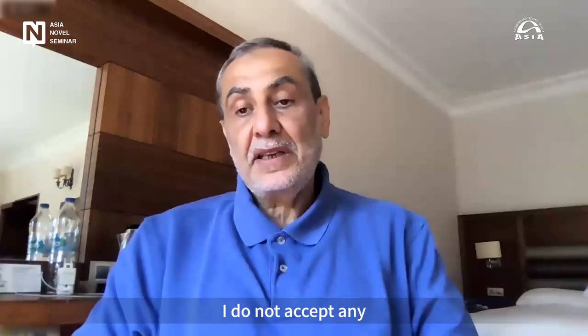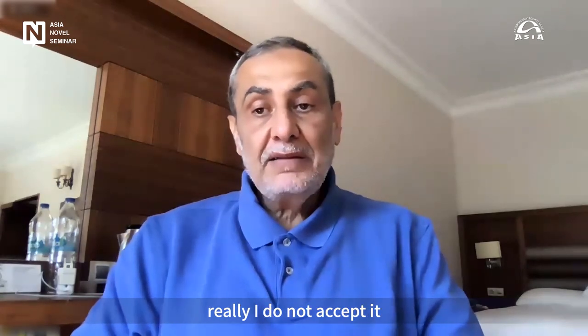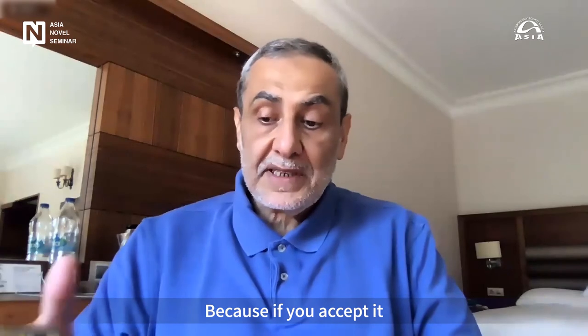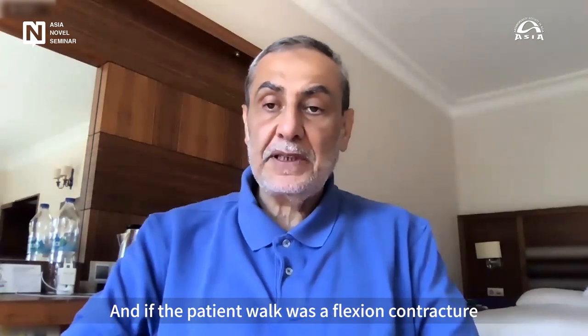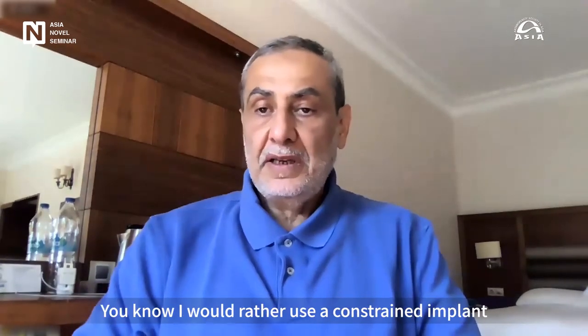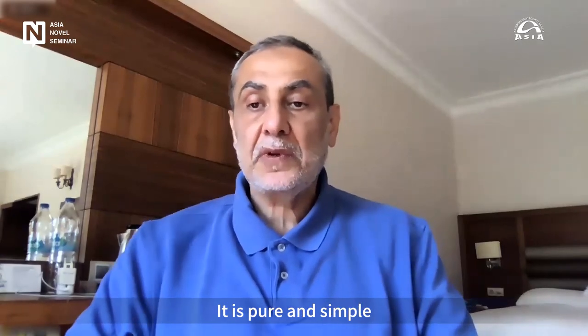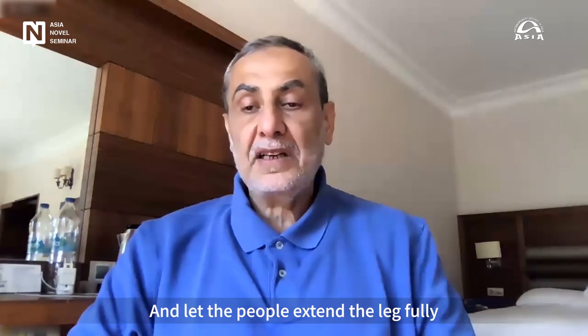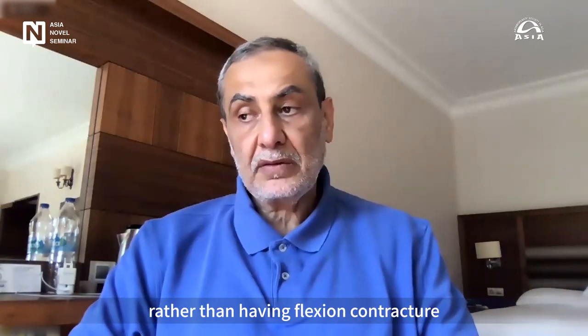I don't accept any. Even if I have to go to a constrained implant, I really don't accept it, because if you accept it, you are bound to have worse. And if the patient walks with a flexion contracture, he's not going to be a happy customer. I'd rather use a constrained implant. It's pure and simple. And let the patient extend the leg fully and let him have a normal activity rather than having flexion contracture.